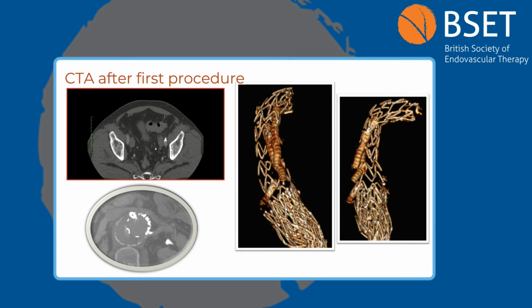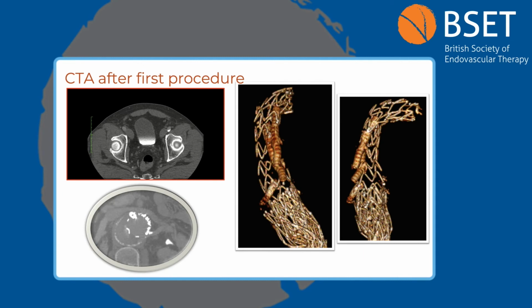Now, this is a CT with limited contrast, and unfortunately, it doesn't depict exactly where the fenestration is, but the fenestration is around here, so it is misoriented, and we have this space, and we have to connect this fenestration to that renal artery.